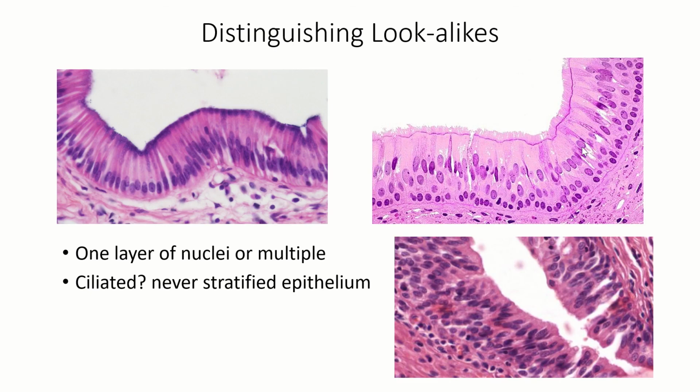So when we look at real tissue, what we see is this. The first thing you look for is what shape the cells are, so we know whether we're looking at columnar, cuboidal, or squamous. And these are obviously tall, thin cells in all of these. And even here, it's kind of hard to tell whether this is all one thing. You've got to look pretty carefully, but they all look like they're pretty tall and thin. All right, so we've got columnar here.